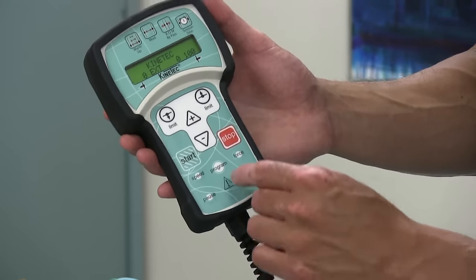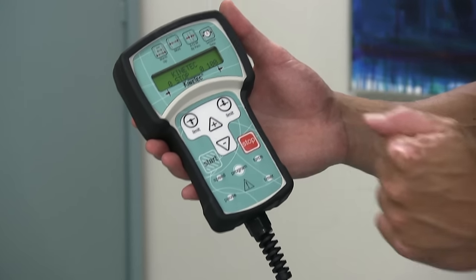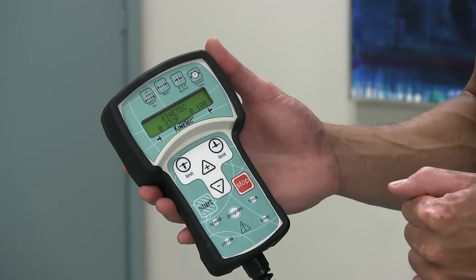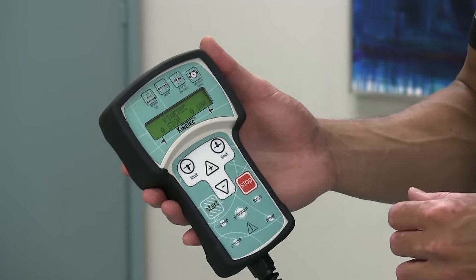As you can see on the remote itself, there's a start and stop button so that the patient themselves can initiate or stop the device at any time, depending on what's happening — for example, if they have to use the bathroom.